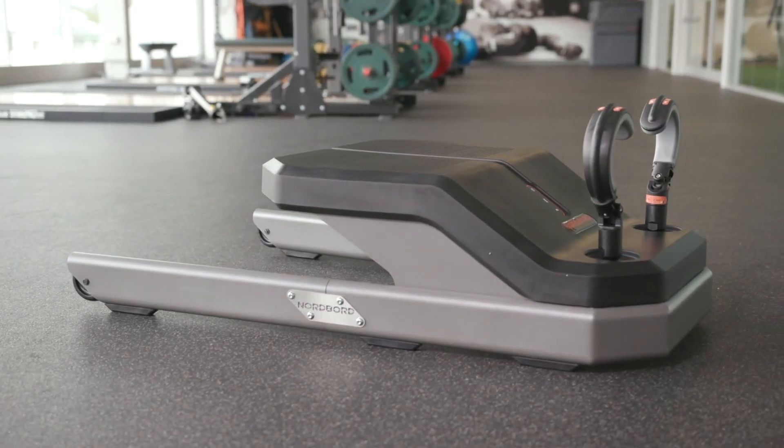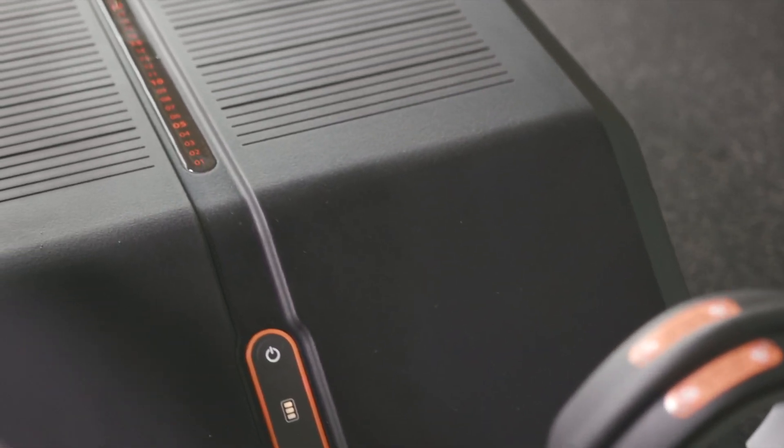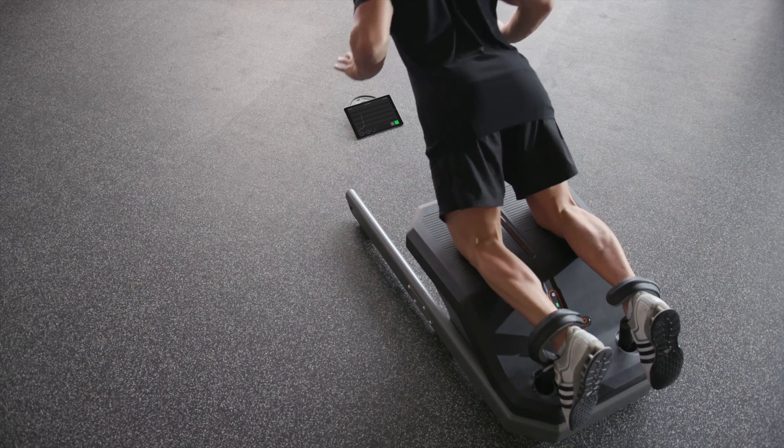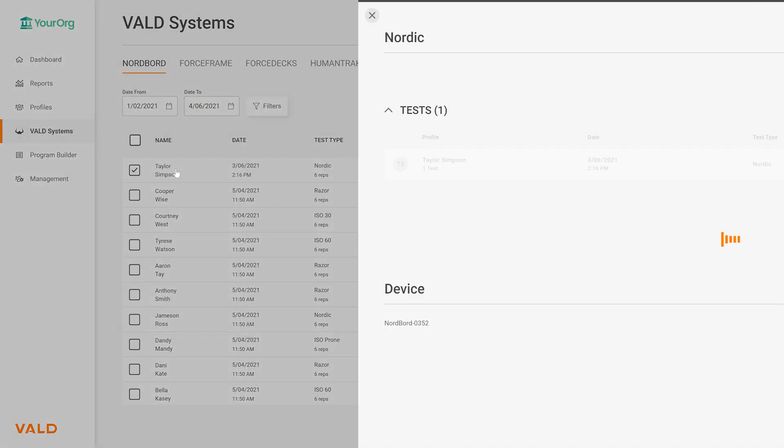The NordBoard is a comprehensive system for accurately quantifying and monitoring an athlete's hamstring strength and imbalance. Combining advanced sensors, real-time data visualization, and cloud analytics, the NordBoard enables high-performance sport professionals to make decisions based on objective data.